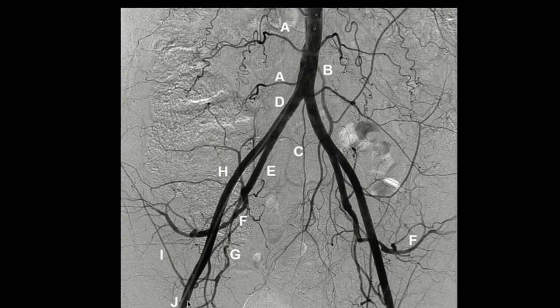This is common femoral. Excellent. I? Inferior epigastric. Okay, well, there's another one that comes off similar in that area. Where does the inferior epigastric artery go? It should be medially, sir. It should be on the medial side.